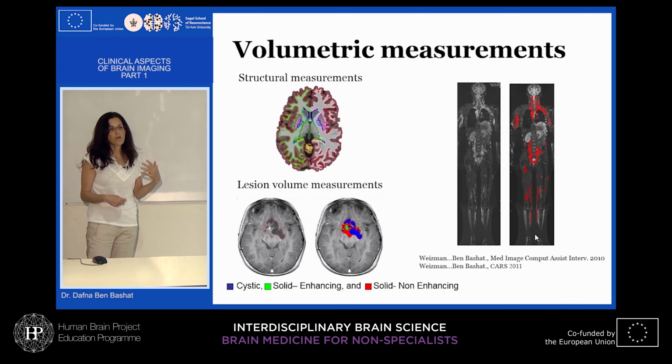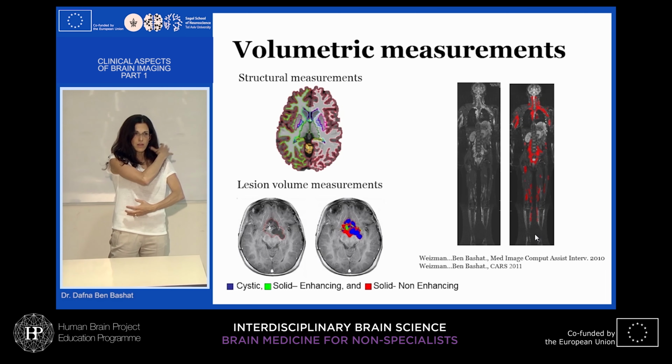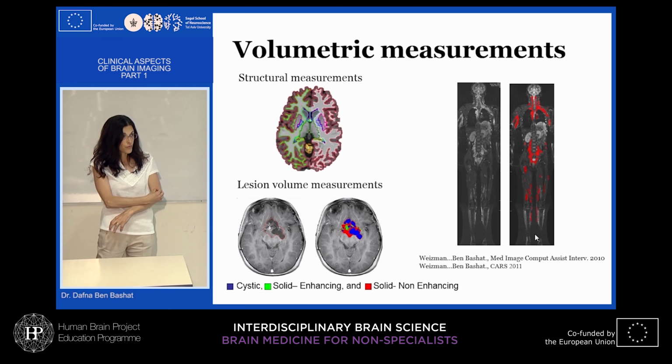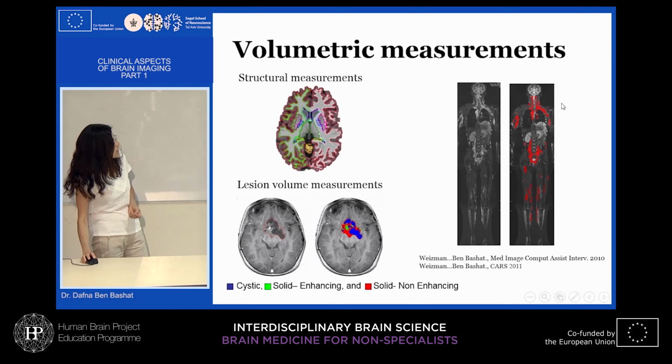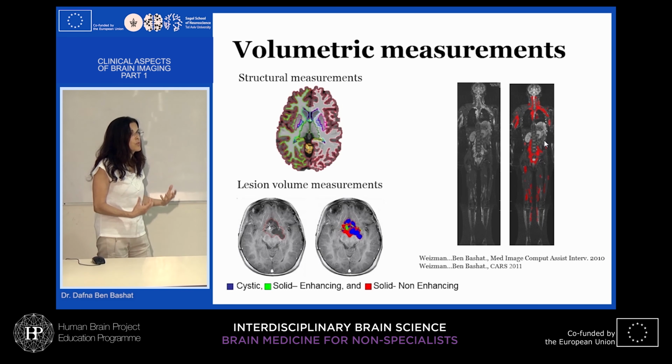And we can develop a tool. This is also a patient with neurofibromatosis, but with a different lesion, what we call plexiform neurofibromatosis. If you know the movie The Elephant Man, they have a lot of lesions on the peripheral nerve, and as you can see here, it can be a total body tumor. So we need to quantify this.